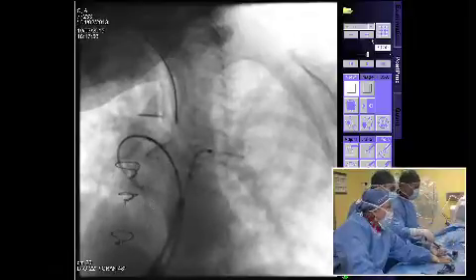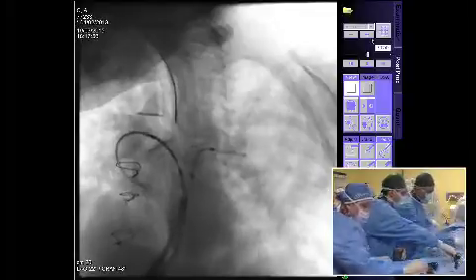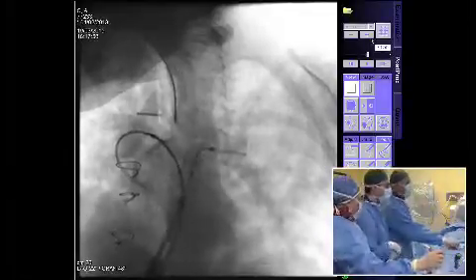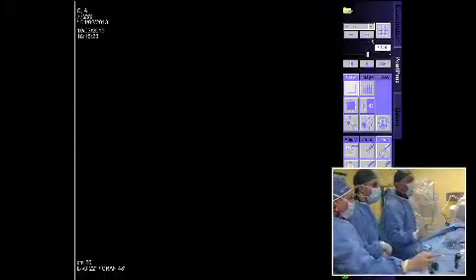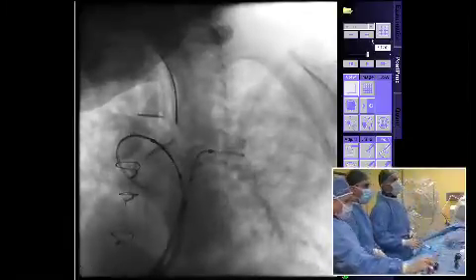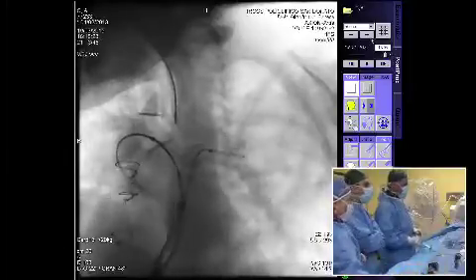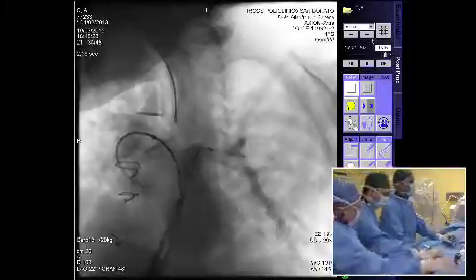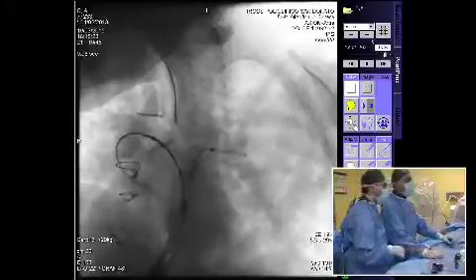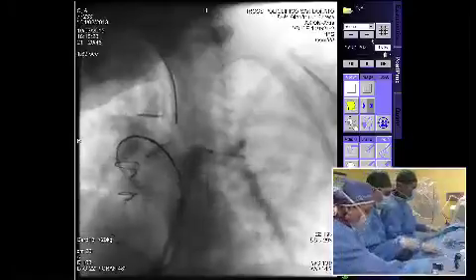So we may do another angio here. Okay, Gianfranco, this looks absolutely beautiful, perfectly positioned. What we would probably like to do is to give you a bit of time to do the angio, measure the pressures, and have Alessandra Frigiola give her talk. Then we'll come back to you with the final result.